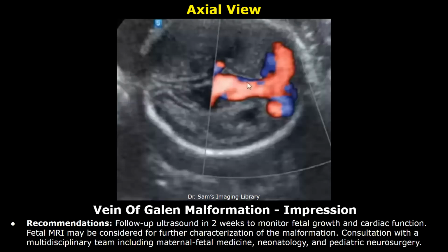Recommendations: follow-up ultrasound in 2 weeks to monitor fetal growth and cardiac function. Fetal MRI may be considered for further characterization of the malformation. Consultation with a multidisciplinary team including maternal fetal medicine, neonatology, and pediatric neurosurgery.